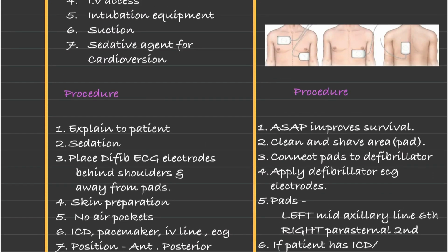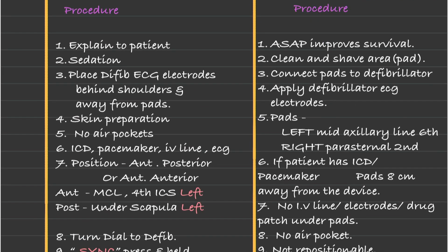If we talk about defibrillation, defibrillation needs to be done ASAP, as I've discussed earlier. It improves the survival of the patient.